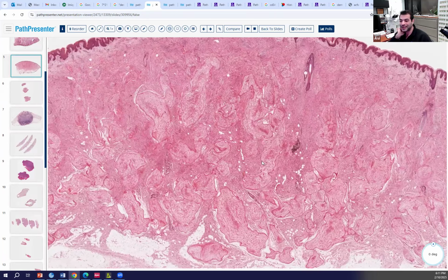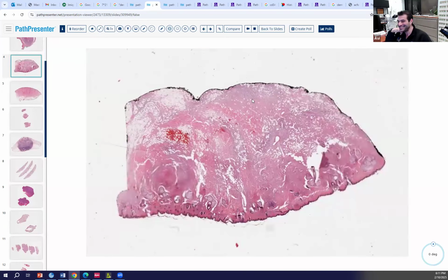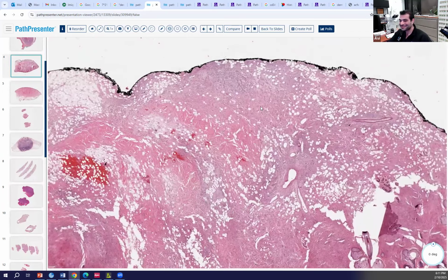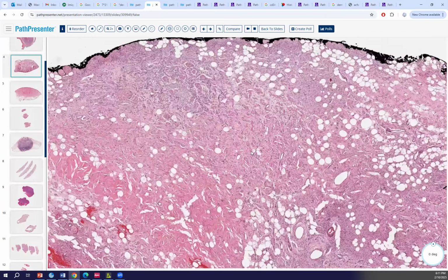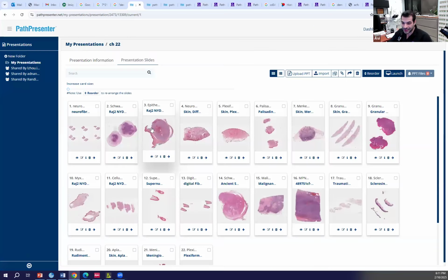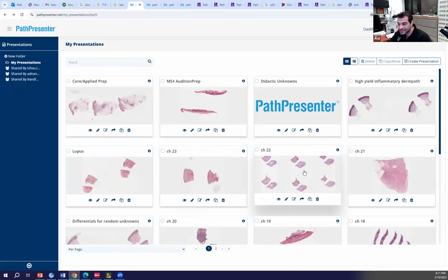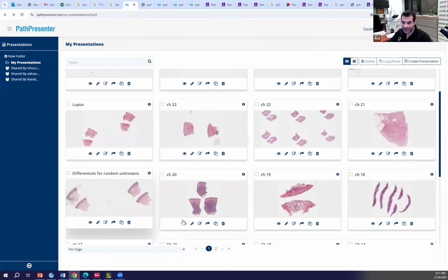What's this architecture look like? Wait, can we go back to the last one for just one second? Sure. What is telling you that is not DFSP? Okay. So remember when we looked at DFSPs? In fact, I'll just pull up the previous chapter because that's where DFSPs are. It's the chapter before the previous chapter.